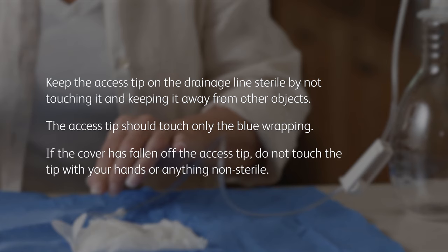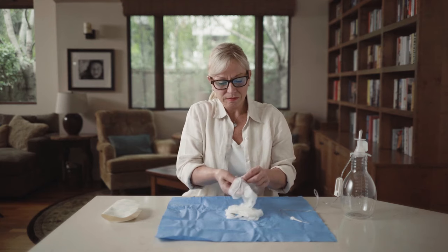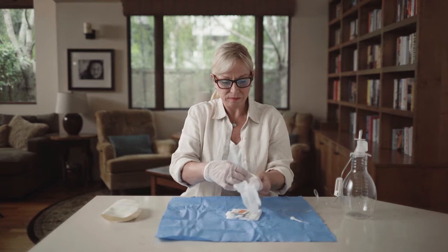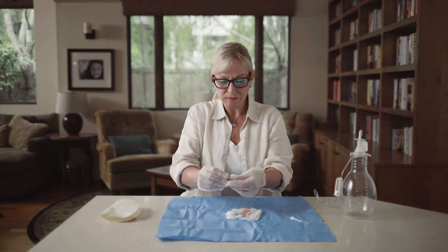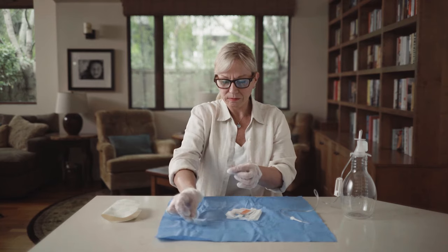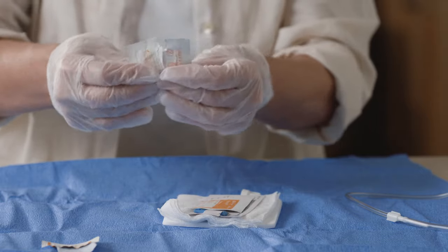If the cover has fallen off the access tip, do not touch the tip with your hands or anything non-sterile. Pick up the gloves by the folded cuffs at the wrist and pull them on. Both gloves fit either hand. Keep your gloves away from non-sterile items such as skin or clothing. Next, open all three alcohol pads and place them on the blue wrapping, but do not remove the pads from their pouches. The alcohol pads are flammable — do not expose the pads to an open flame.